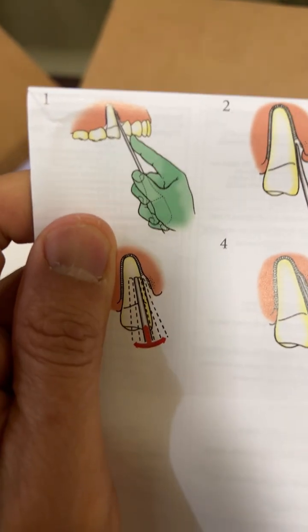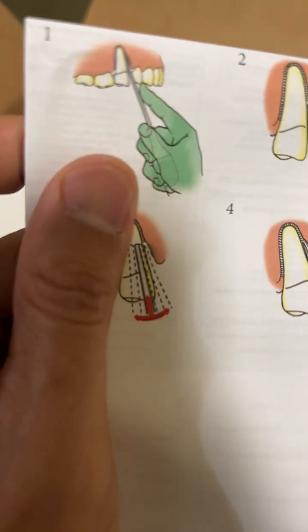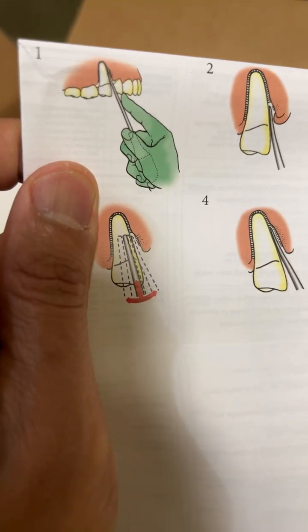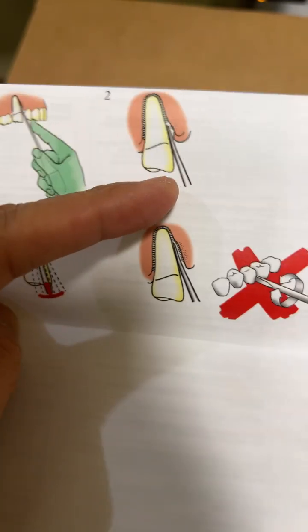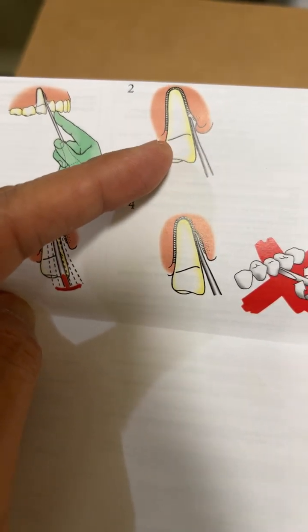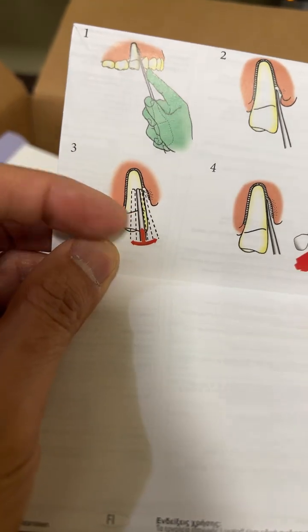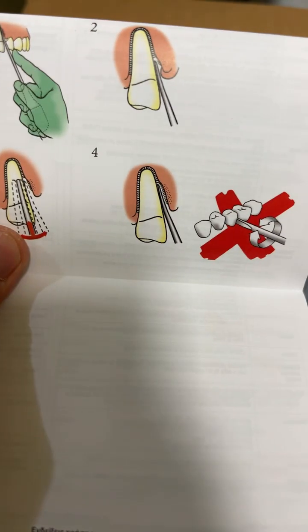Really quickly — here's how you use it. You want to use a finger rest on the shank and just push it in. There's also a second way: first you aim it, move it in, go around, and then you also go around as shown right there.